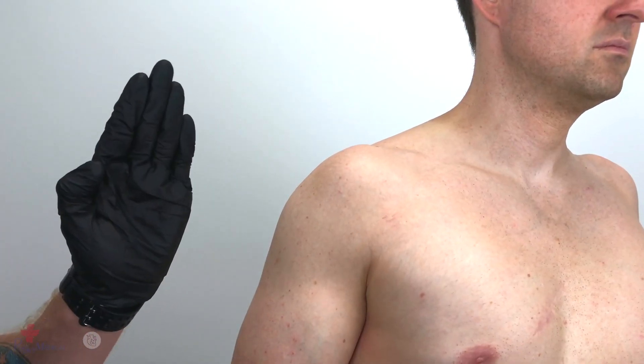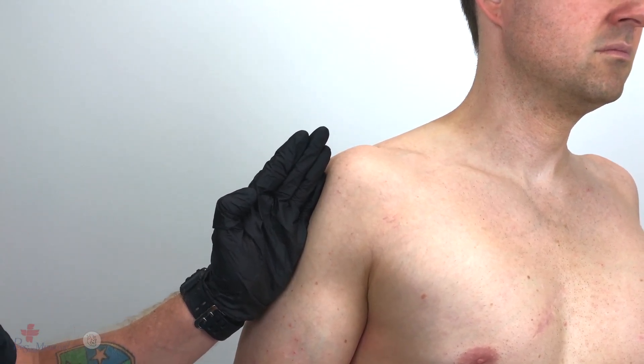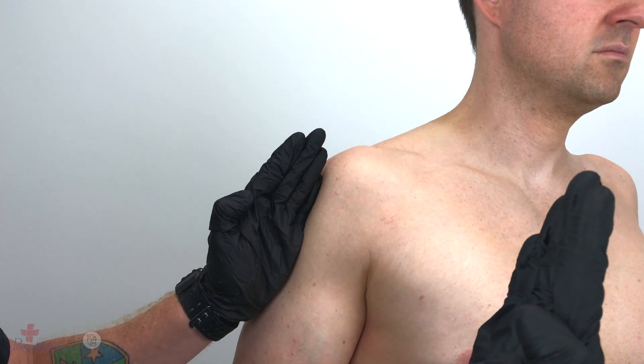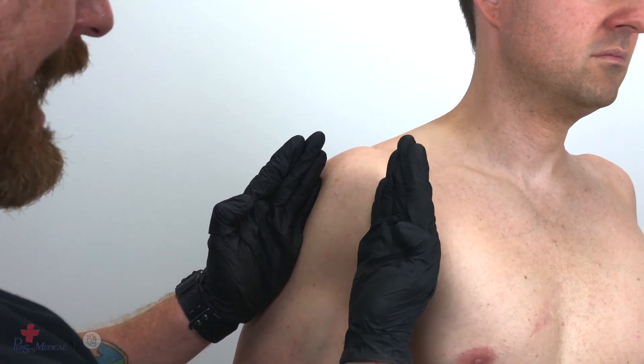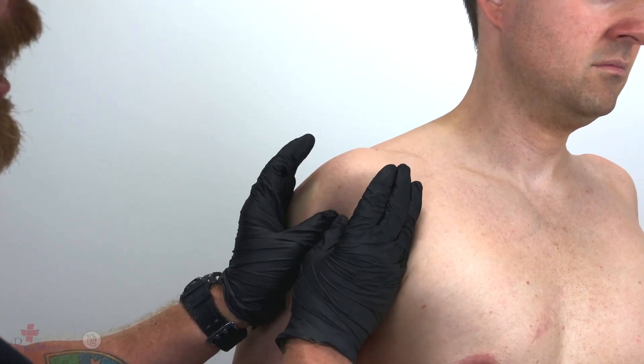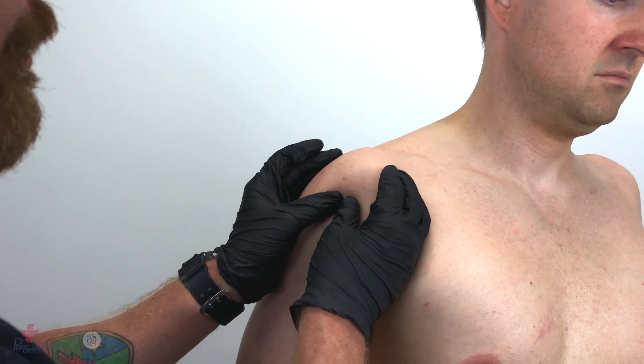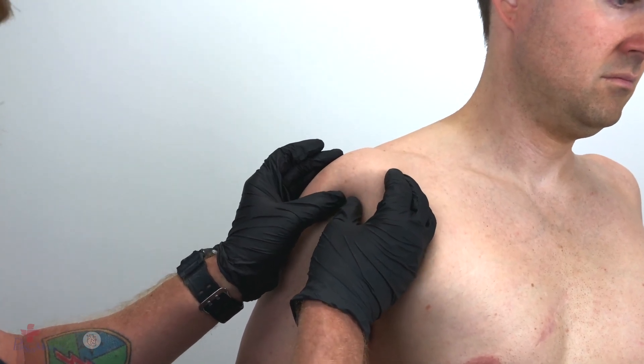With one hand, form a knife cutting edge. Bisect the arm at the deltoid. With the other hand, form another knife cutting edge and bisect the axilla anteriorly. Rotate both hands inward until the thumbs meet. Palpate the surgical neck of the humerus and move upward until you locate the greater tubercle.